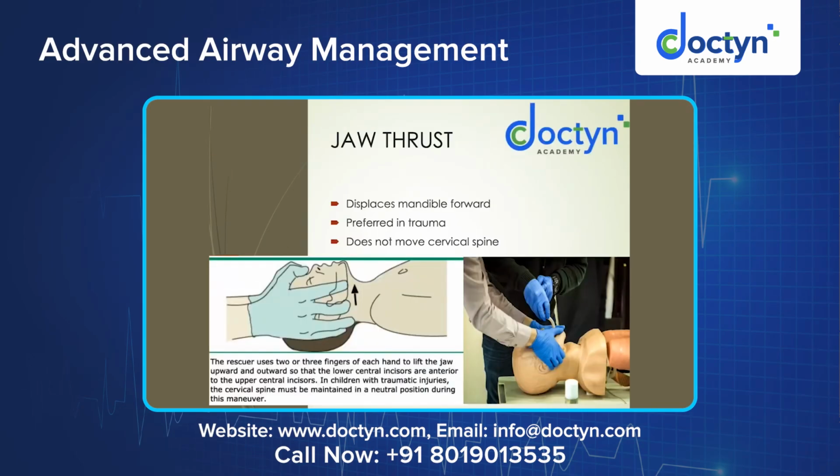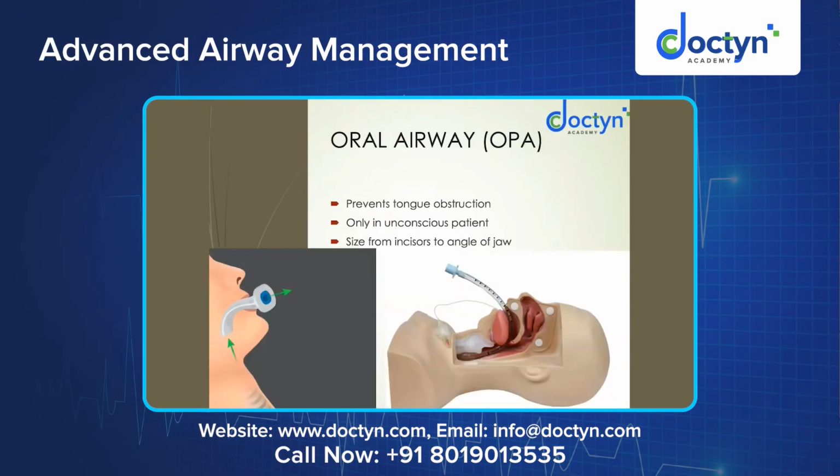Jaw thrust is just displacement of the mandible forward, which helps move the tongue away from the oropharynx and opens up the airway again. So this will not cause any movement at the cervical spine. If you have a trauma patient or a query cervical spine injury, we avoid head tilt and chin lift and do a jaw thrust to open up the airway.